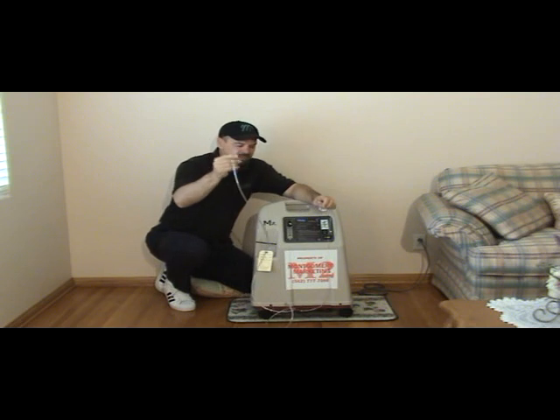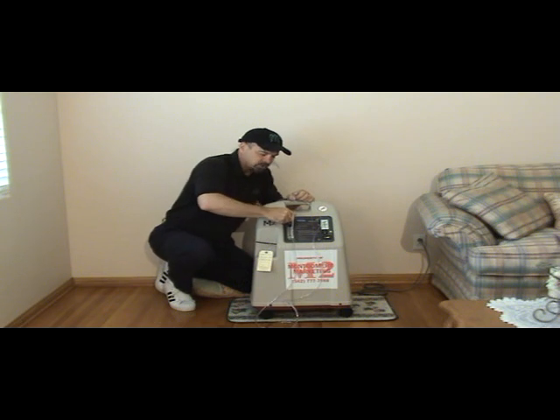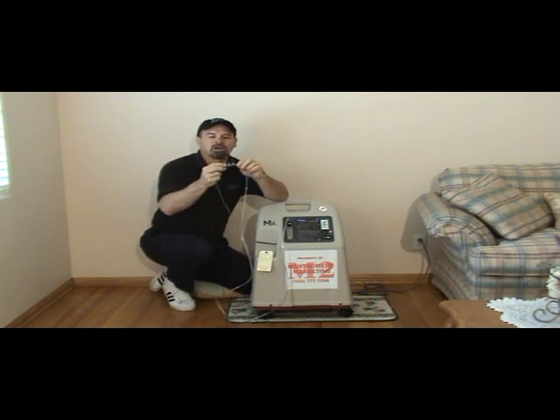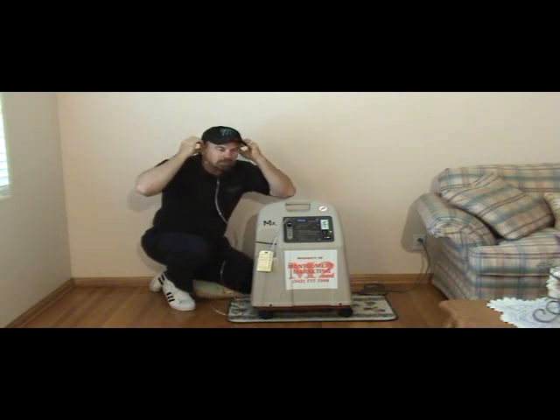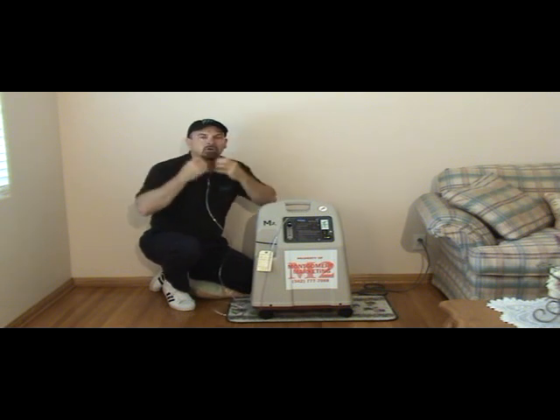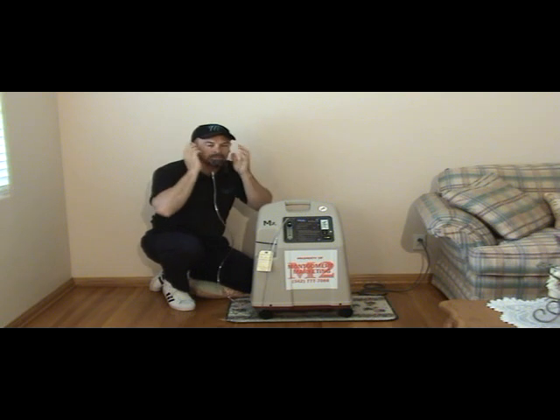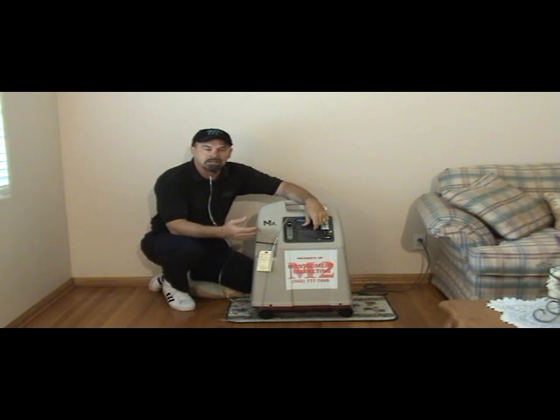So the first thing we're going to do is connect this to the concentrator. So basically, you just press it onto the nipple until it goes on completely. Then, if you were going to put this on the patient, you would position the prongs so that, again, they're curved down. They would go into the nose. Then you take the tubing to the side and you bring it up around the ears. Everything with the tubing, the nasal cannula, always stays in front. Then on the front of the nasal cannula here is sort of like a bolo tie where you just cinch it up to keep it in place. So everything always stays in front. Okay? This is a nasal cannula. This is the easiest way and the most common way of providing oxygen to the patient.